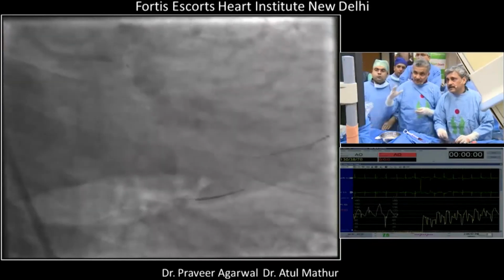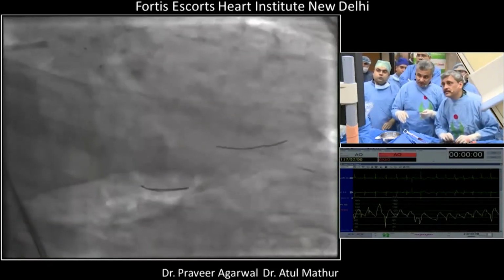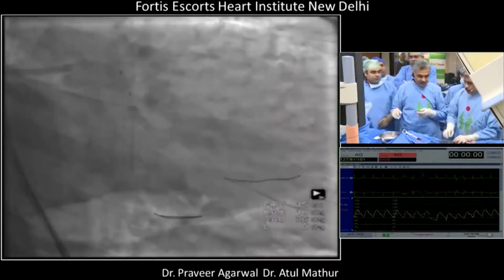Yeah, it is going this way. Let's see. It's going. Yeah, it's going. There we are. Okay, wonderful. Thank you very much. So we are through.